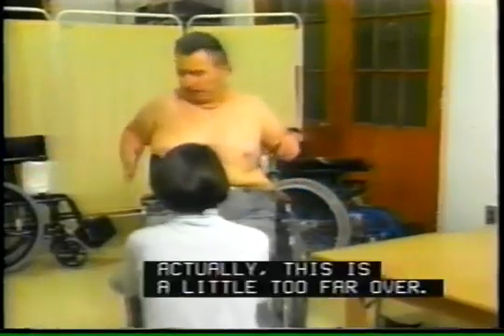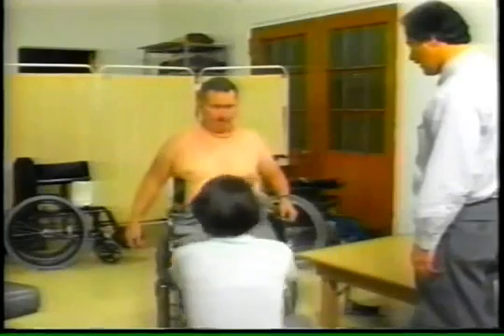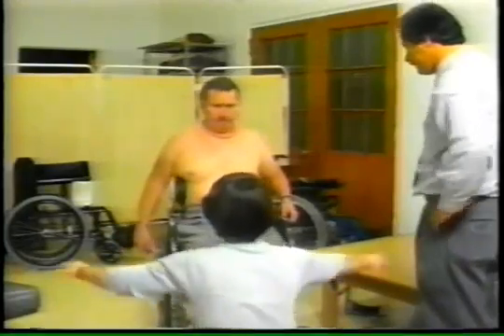Still losing you. Yeah, it's actually a little too far over. Okay, do one more lift up. And I'm going to actually move this in a little bit. Okay, now come down. Okay, now.